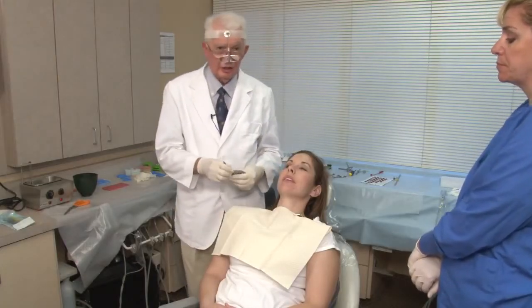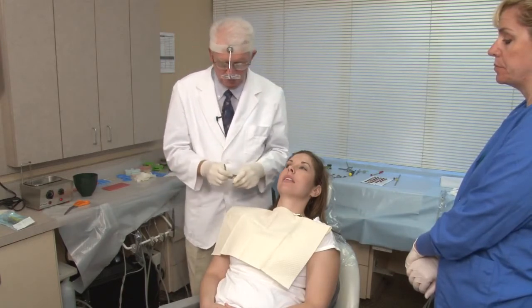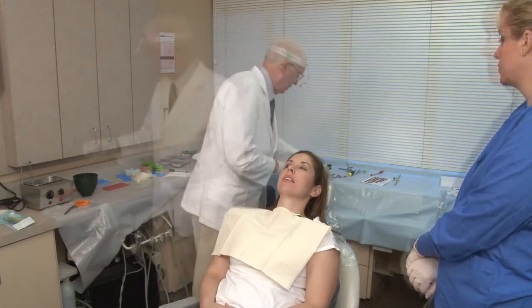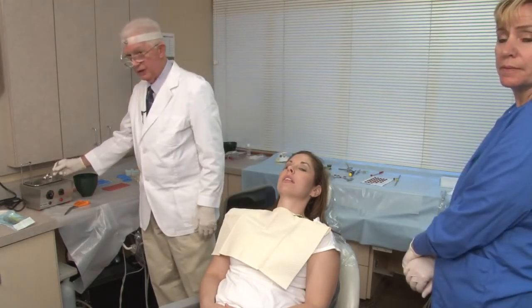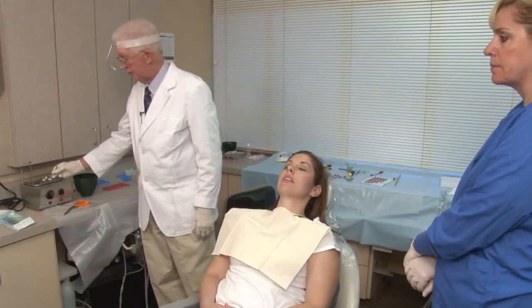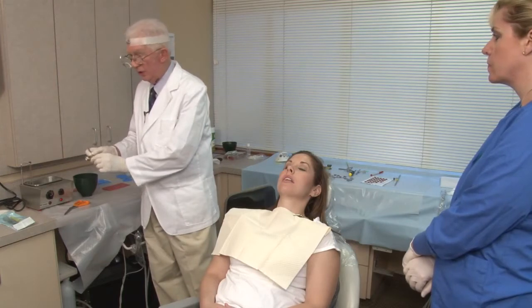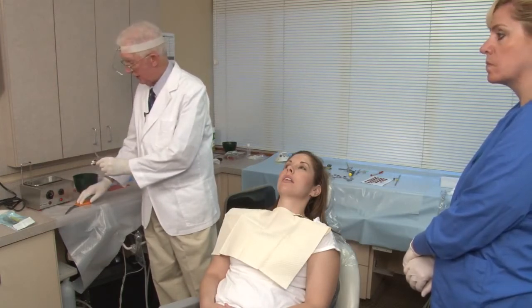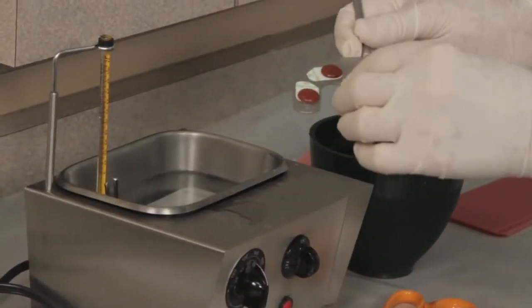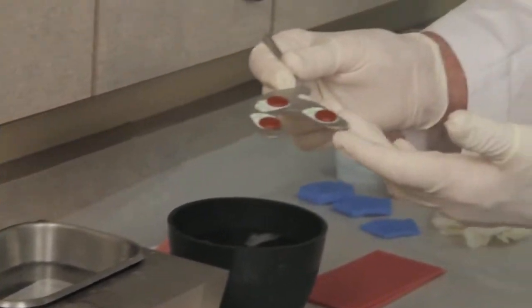Now, the next thing that is very important you'll see me do, we'll be using the water bath to soften the bite tabs. When the bite tabs are soft, remember now, they soften at about 120 degrees, so your water bath is a little warmer than that, so you have to be careful. So we put it in, and then I'll feel. When they feel soft, remember, you've also heated the metal.